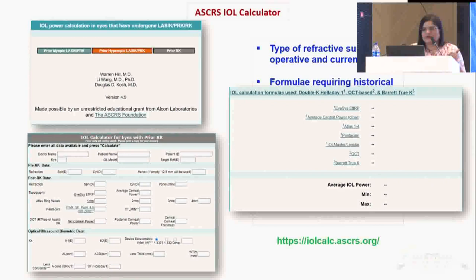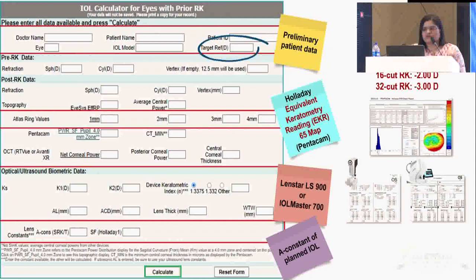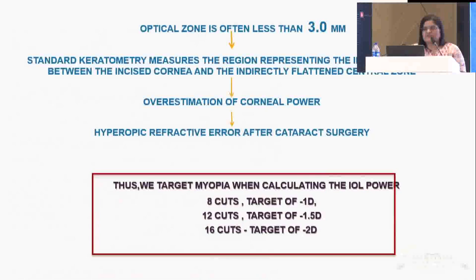Here we have to talk about the prior RK, that is the target refraction. Since this is an eye which will go into hyperopia later on also, with 8-cut RK, you have to aim for minus 1. With 12-cut RK, minus 1.5. 16-cut RK, minus 2, and so on and so forth. We can enter the values of the EKR Holladay map or the Atlas ring values, which is actually the correct method over here. But you can also go for the A constant, which is the planned IOL.